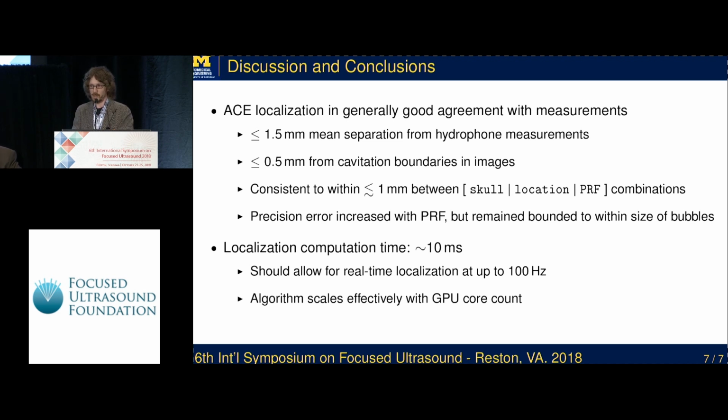So we were able to get generally good agreement with the measurements from hydrophone and cameras, less than about 1.5 millimeter separation. In general, compared to the camera images, we were within 0.5 millimeter of the boundary, and consistent between experiments looking at the different combinations of skull, location, and PRF. The error increased with PRF, but it was bounded to within the size of the bubbles that we actually did measure, so it's still pretty accurate.